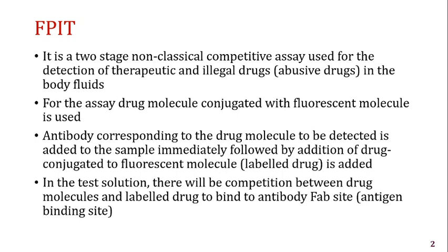It is a two-stage non-classical competitive assay used for the investigation of therapeutic drugs which are used for the clinical purpose, treatment of diseases, as well as it is used for the detection of illegal drugs, that is abusive drugs. Similarly, it is also used for detection of abnormal illegal hormones which are used for performance enhancement. And all these investigations can be carried out in the body fluids like serum, plasma and urine.